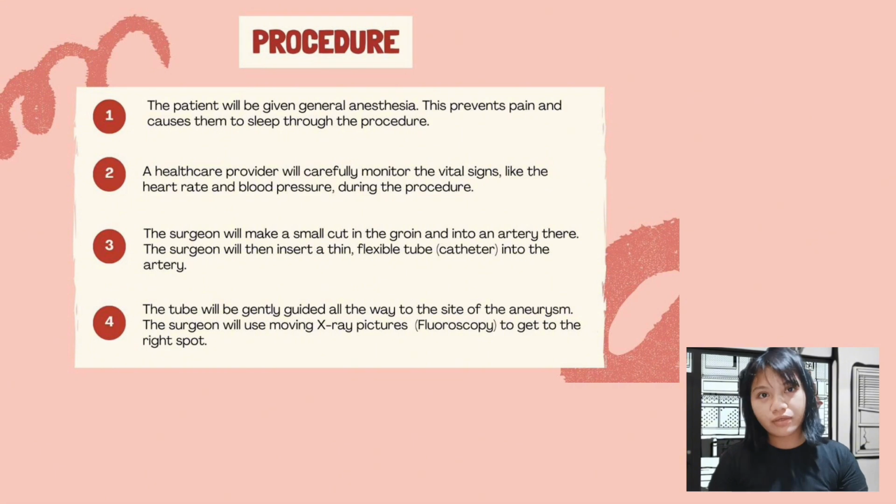The patient will be given general anesthesia. This prevents pain and causes them to sleep through the procedure, allowing the healthcare provider to perform the necessary work without causing discomfort to the patient, and the medications can be delivered through an IV.